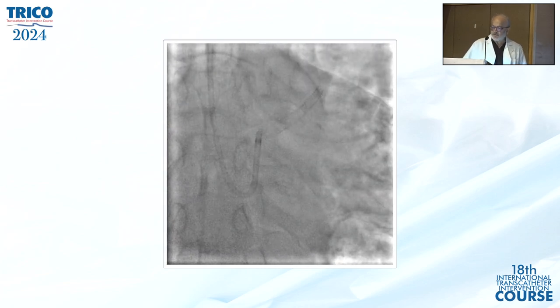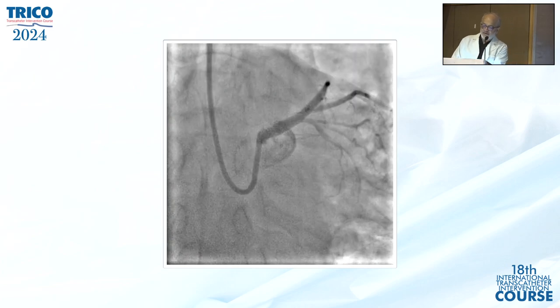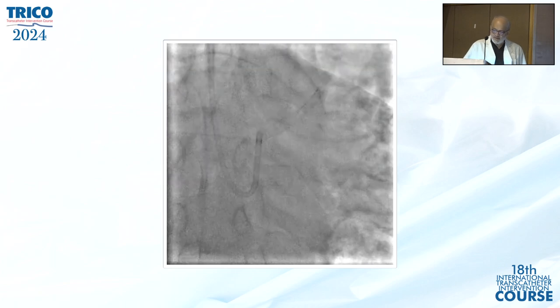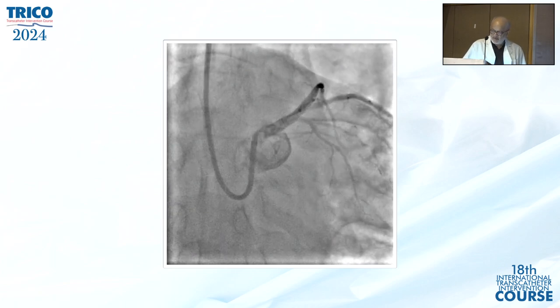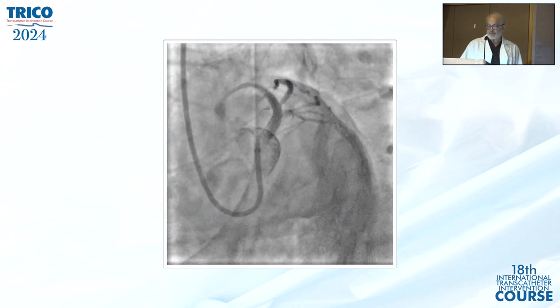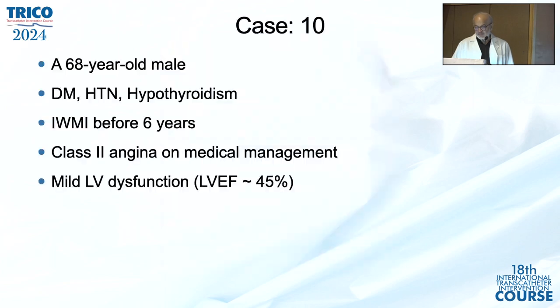We stented that too. And then crossing the circ and crossing the diagonal, we did a sort of kissing balloon. And then we had an OCT picture, perfect result. Patient was saved. This was a real nightmare to us.